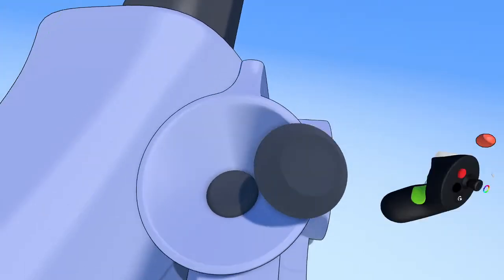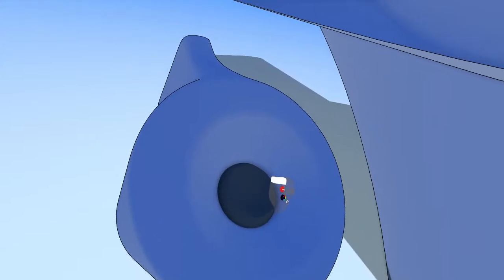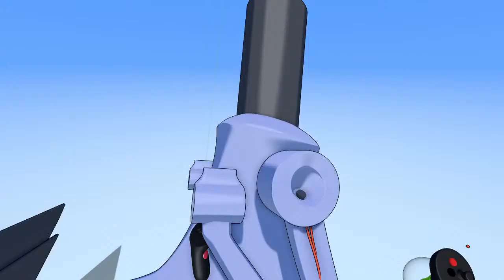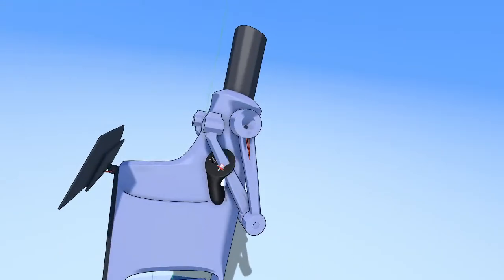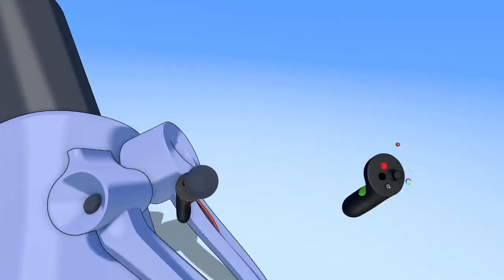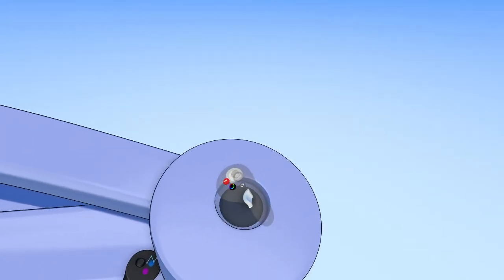And this is kind of what I was saying about not being too precise. If anything, I've probably been too precise for this entire demo. I mean, you could just take shapes and drop them in like that, and again, for the purposes of a render, it works really well. You can even do the same thing here. Just duplicate that same shape, drop it over here. Give ourselves a little end cap.